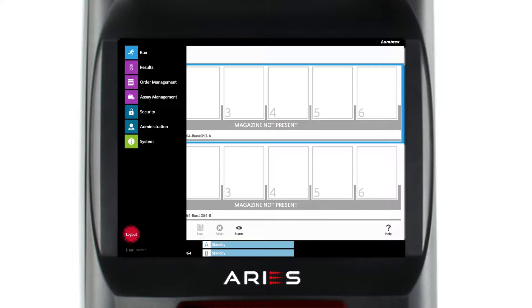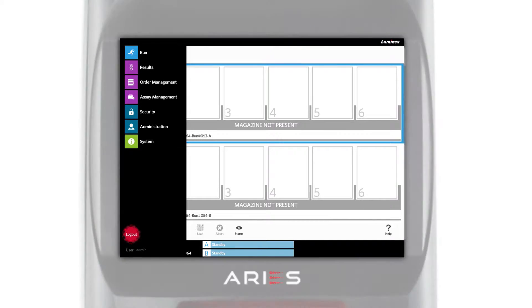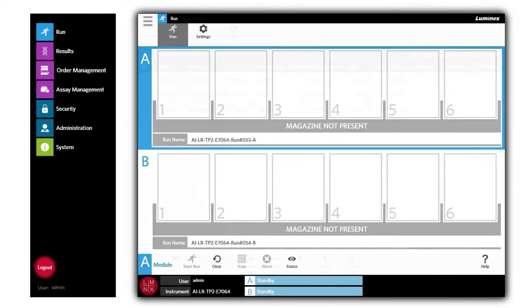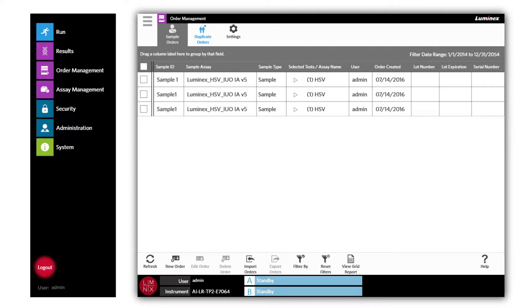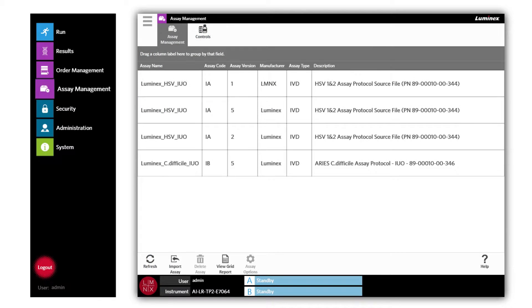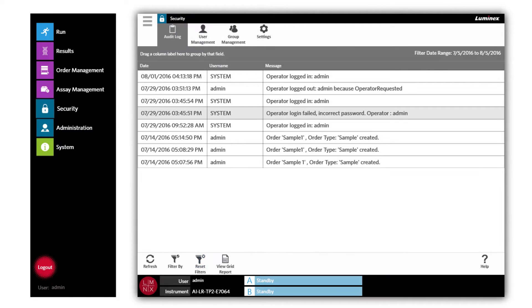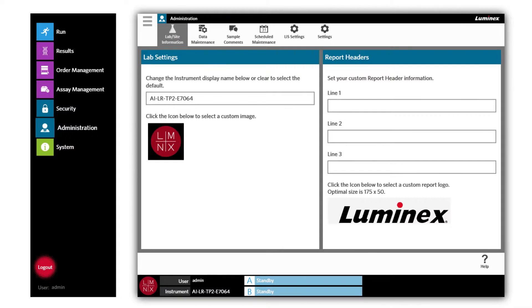End users navigate the ARIES software through apps. From the apps, users can create and manage orders, manage assays, view, print, and export results, control the system security, and control the system's admin settings.